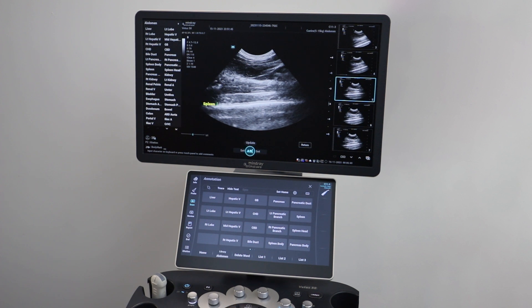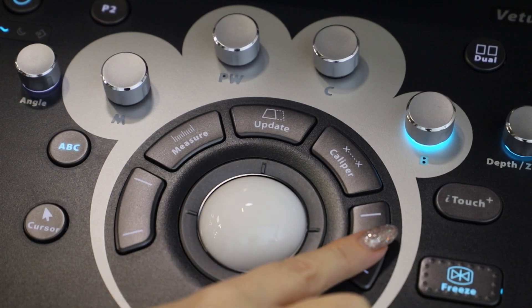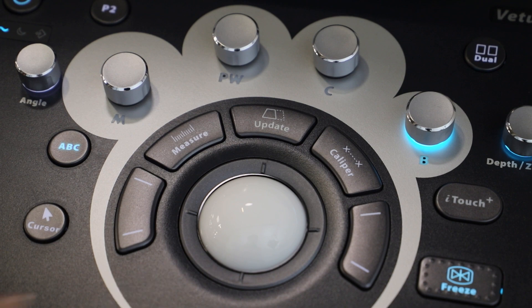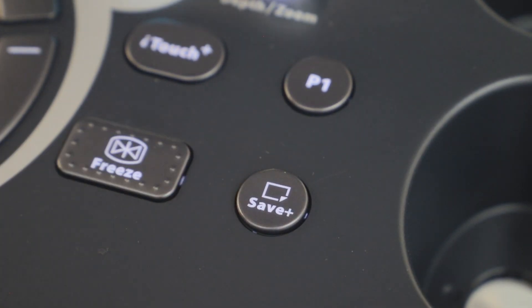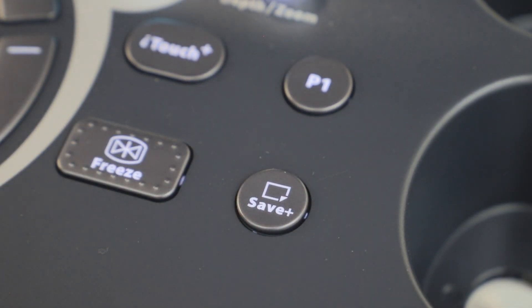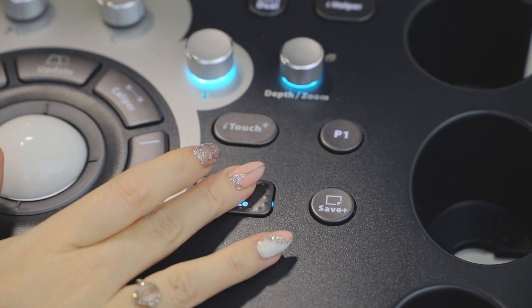When happy, click down on either the left or the right button next to the trackball as shown. Remember to click save to save your image. To go back to live scanning, click freeze.